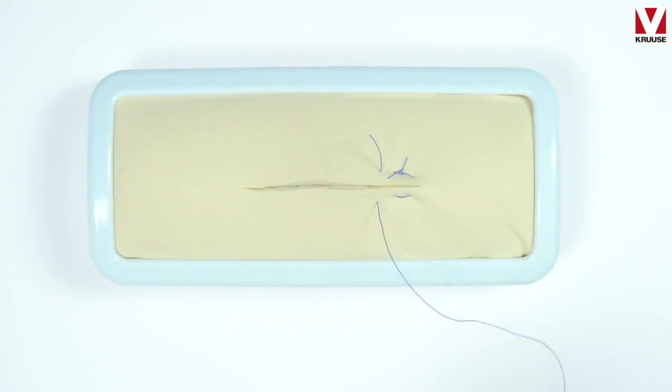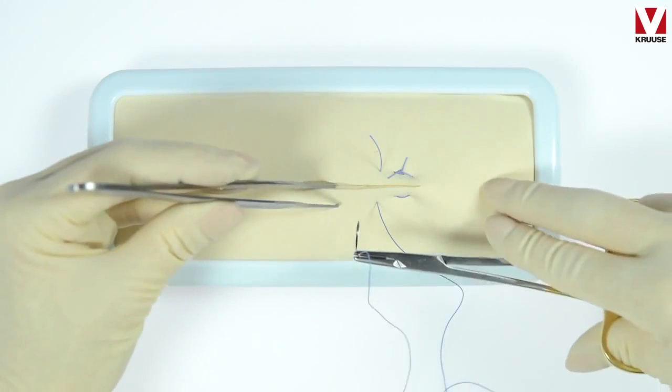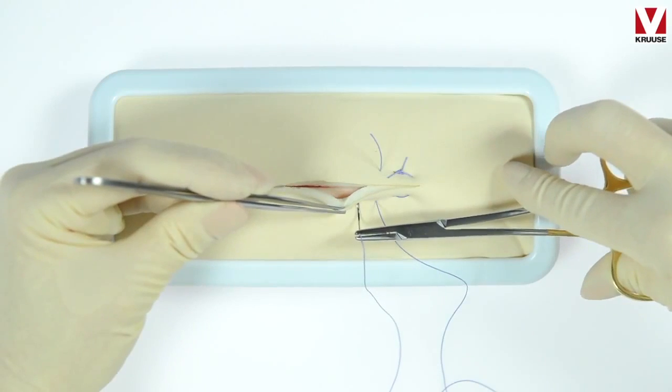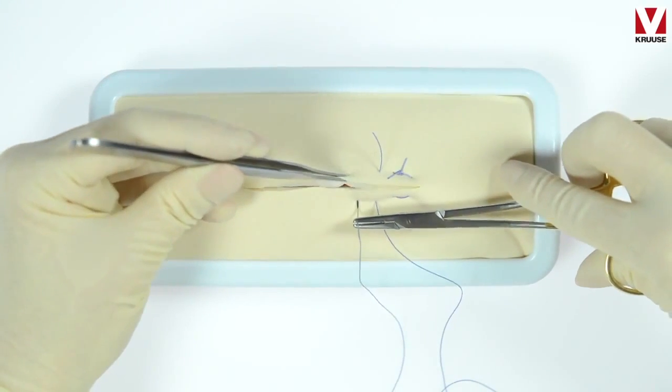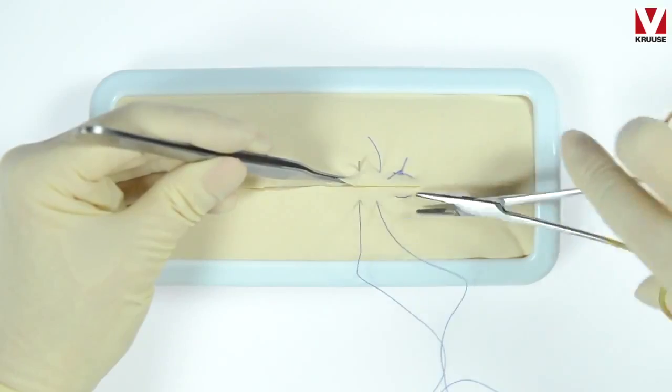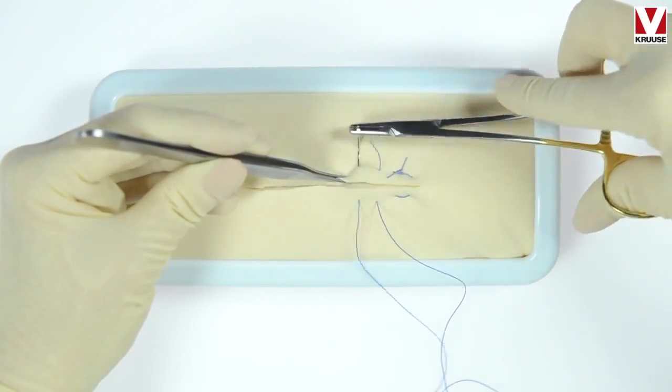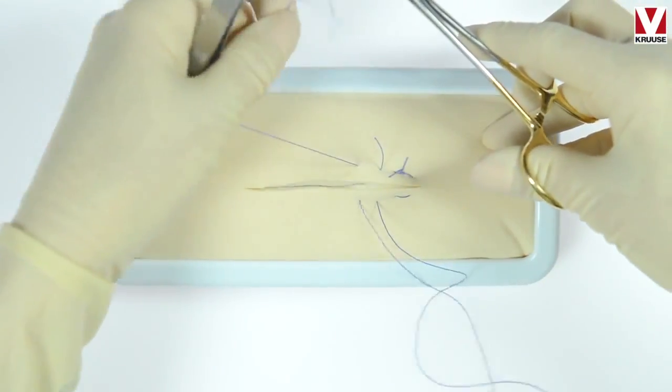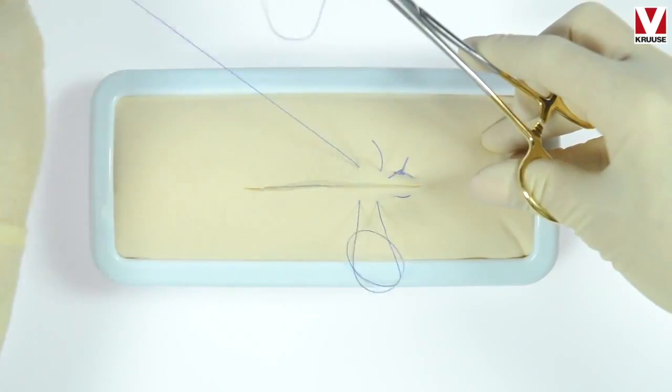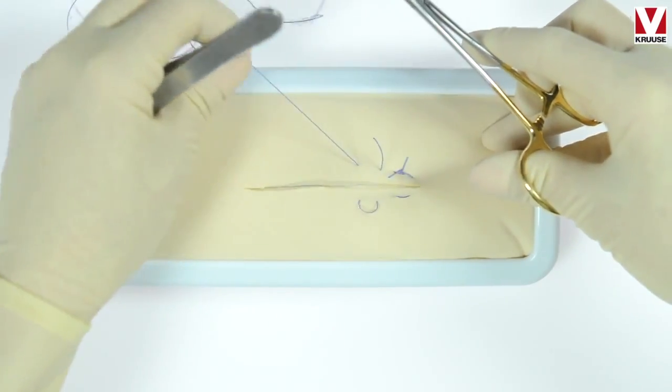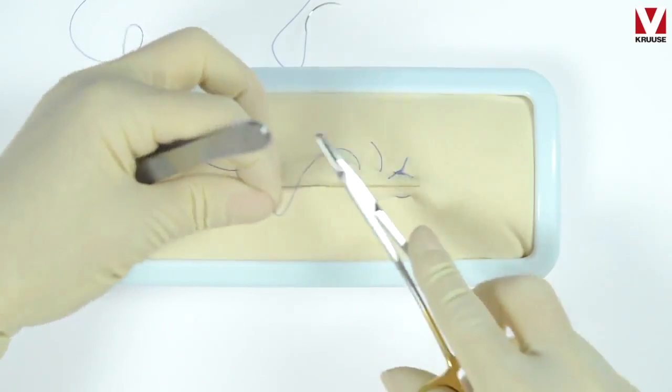I load this suture again with the needle holder opposite of what I normally would do, and then I make the knot. You see here we make the knot with another pattern where you make three throws instead of two.